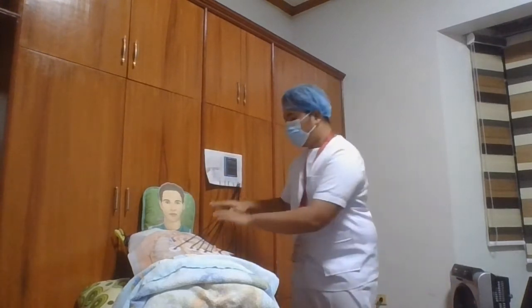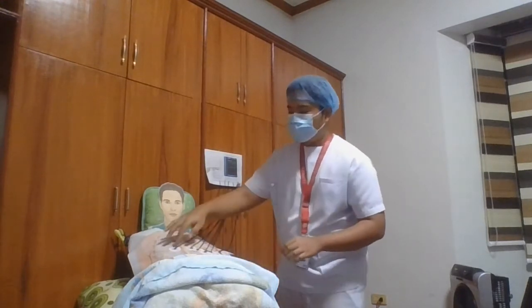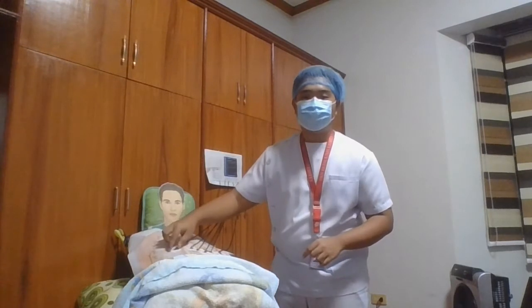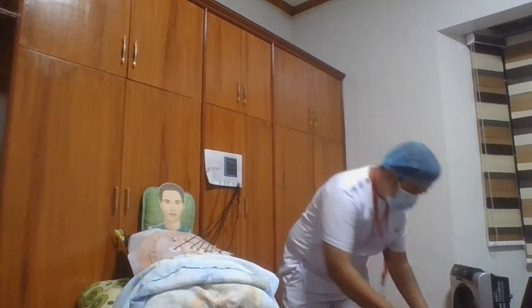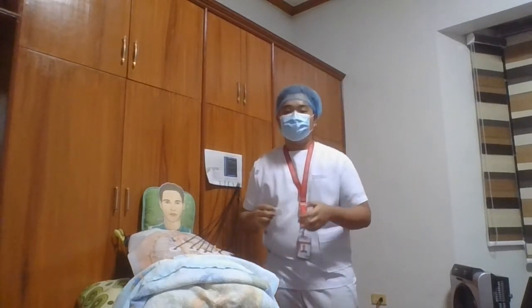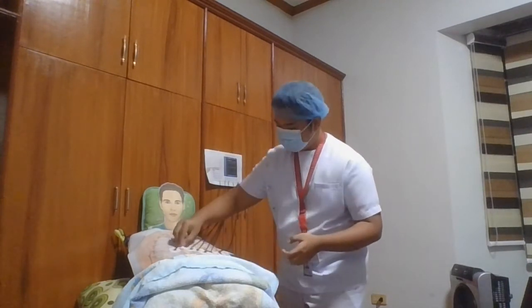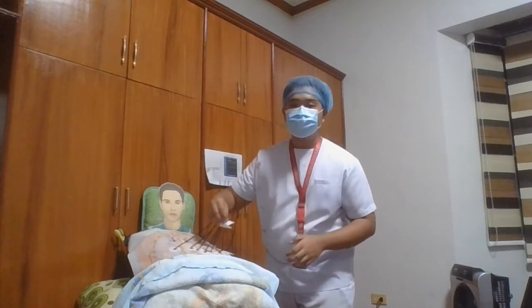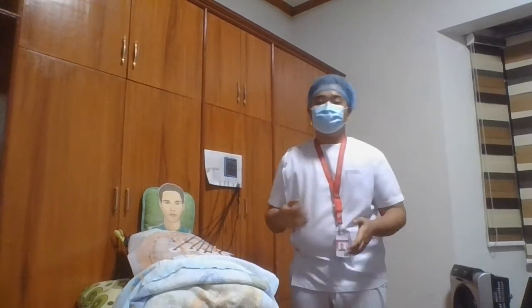Let's say that I have already removed the cables since it is hard to remove because this one is paper and it can tear upon removing. Afterwards, we're going to clean the patient's skin for any residual gel from the electrodes and we're going to assist the patient. So we're going to clean the patient's skin and then assist the patient in redressing in his gown or clothing.